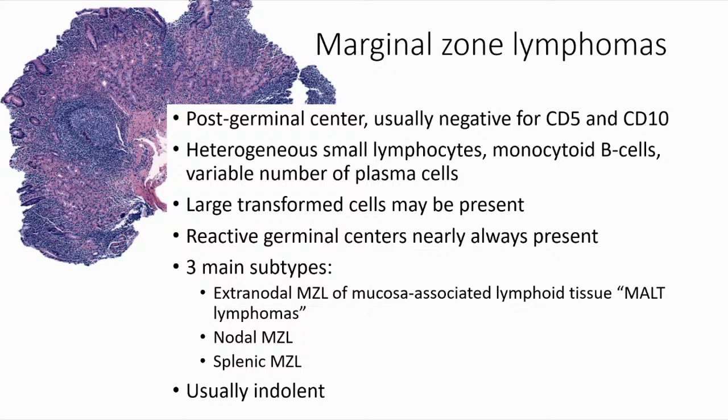So I usually don't go too much to town on the stains, other than obviously adding the CD43 as well in some cases. But I think the combination between the extent of CD20, CD79A that you have, and the morphology is the most helpful. Rather than doing stains ad infinitum, maybe do a shorter number of stains, and then ask, do I have a B cell clone here, and is there H. pylori? Then okay, you need to treat the H. pylori. This could be evolving marginal zone. Then we'll recheck it after treatment and see what the status is.